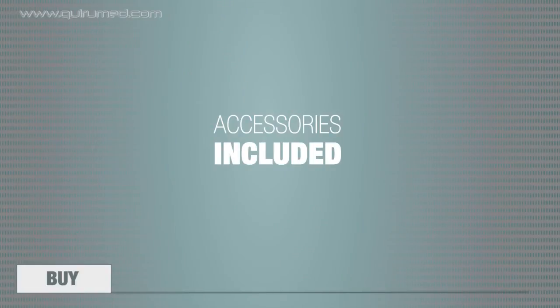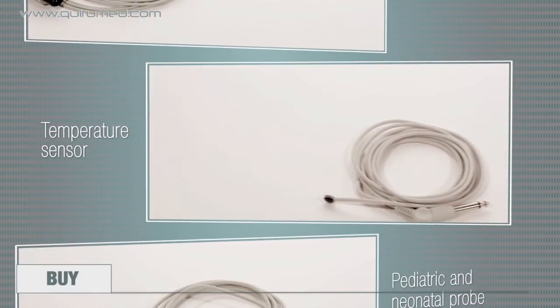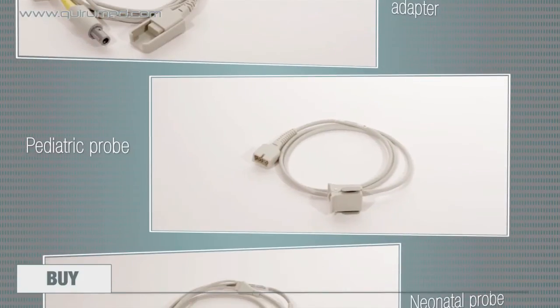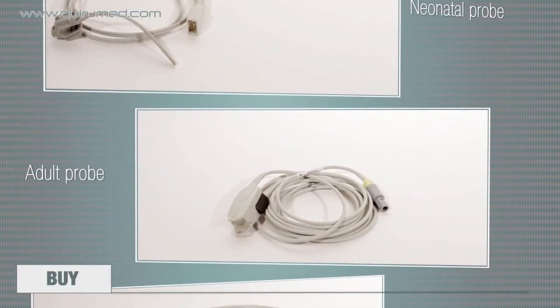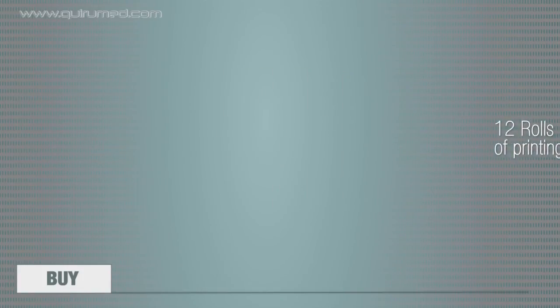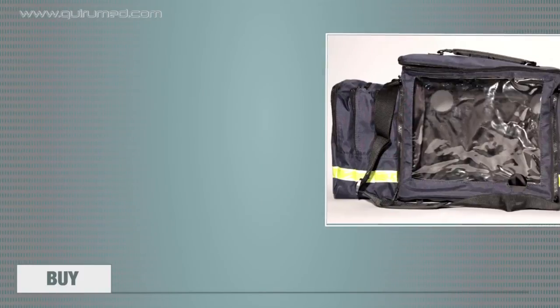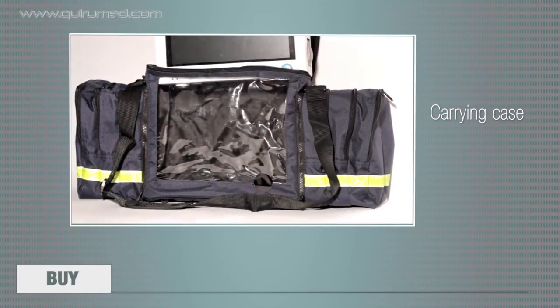The accessories included in this kit consist of an ECG cable, a temperature sensor, a pediatric and neonatal probe adapter, a pediatric probe, a neonatal probe, a probe for adults, and a cuff extension tube. In addition, it includes 12 rolls of printing paper, circular electrodes for ECG, and a carrying case that will allow you to protect and comfortably carry the monitor and all of its accessories.